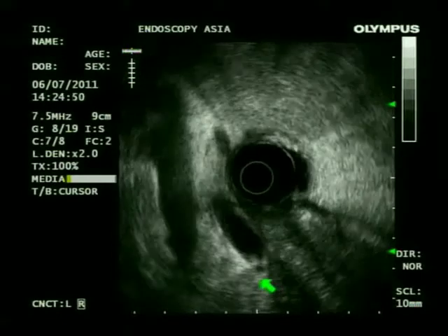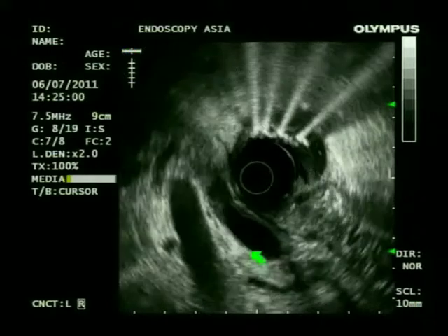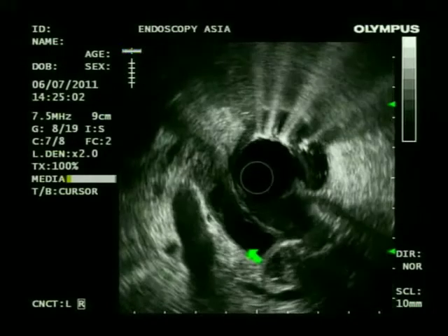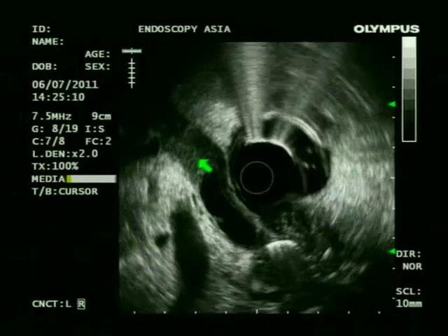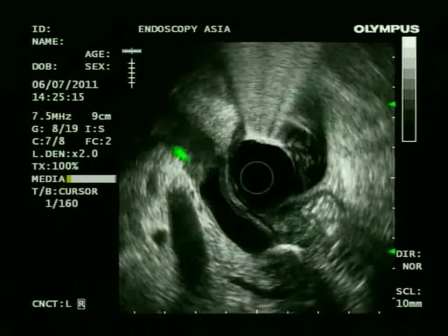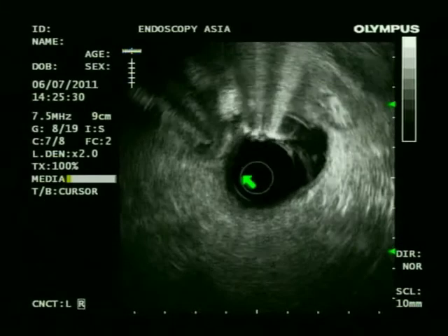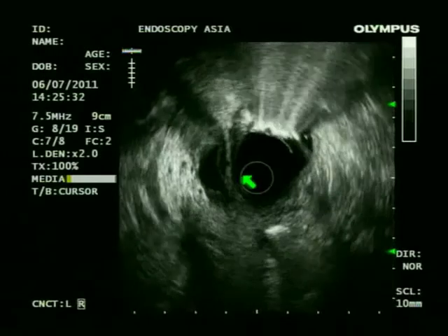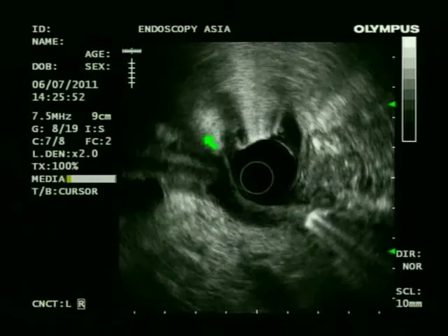This is important for endosonographers to keep in mind when they are evaluating the absolute lower end, especially when the bile duct and the pancreatic duct is opening on the edge of a diverticulum. Here you can see where my arrow is pointing, hypoechoic lesion in the bile duct, probably a cholangiocarcinoma.